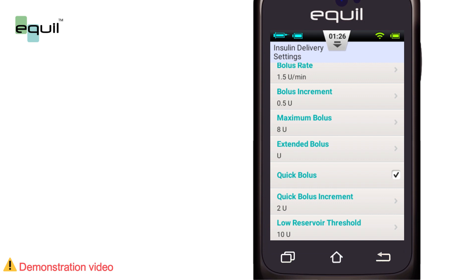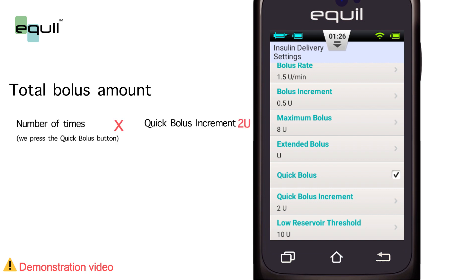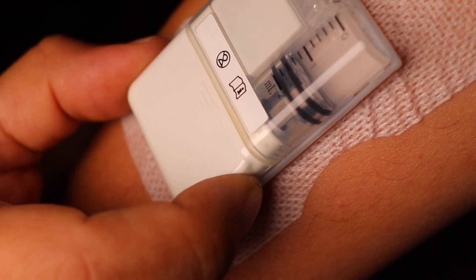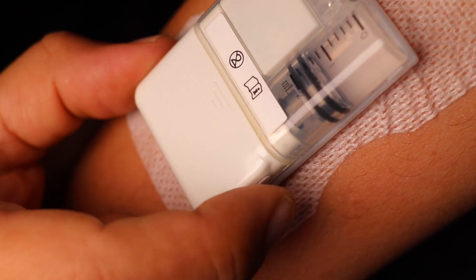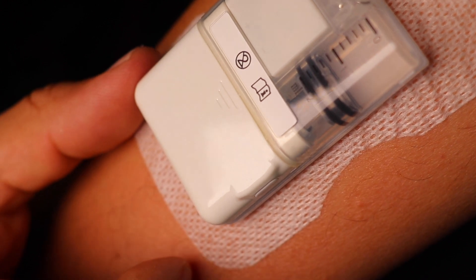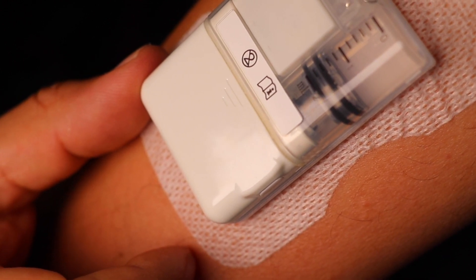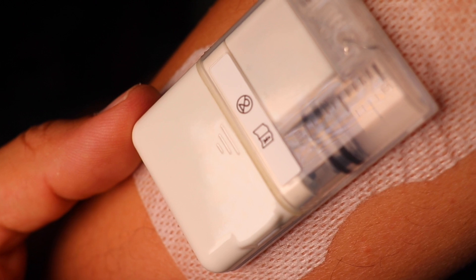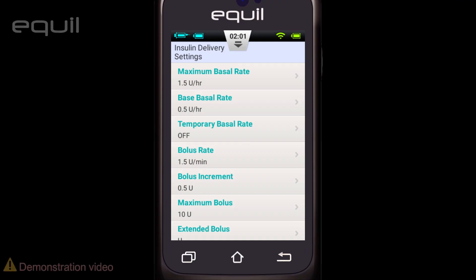In other words, if the bolus increment amount is 2 units and you need to administer a 10-unit dose, press the button 5 times. Every time you press the button, you will hear a beep from the pump to confirm it was pressed. The tone associated with each press will ascend in pitch up to 5, to help you remember how many times you have pressed the button.